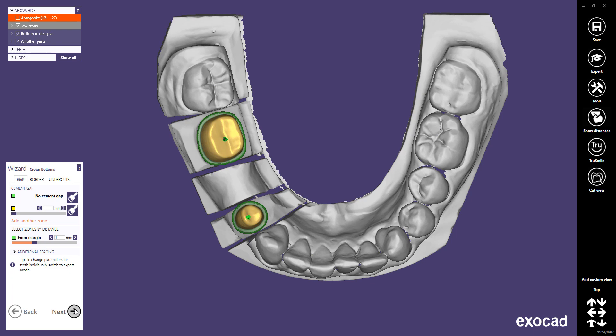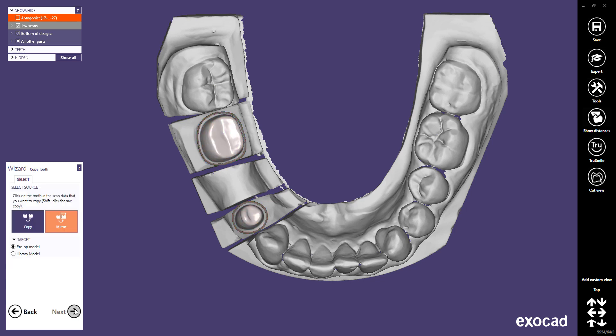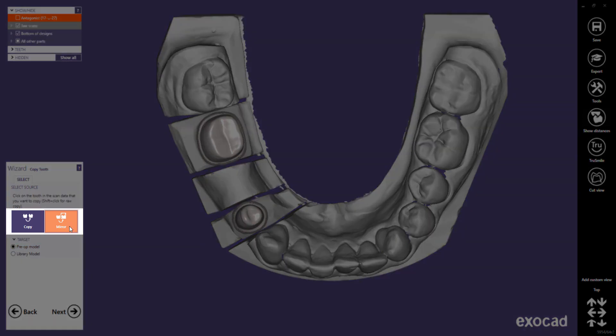This quick guide tutorial from ExoCAD will demonstrate in detail the Copy Tooth feature. Starting with ExoCAD version 2016, the Copy Tooth step will come after the Crown Bottom step in the wizard. This feature allows you to mirror teeth from the opposing quadrant, or to copy teeth from the same quadrant.